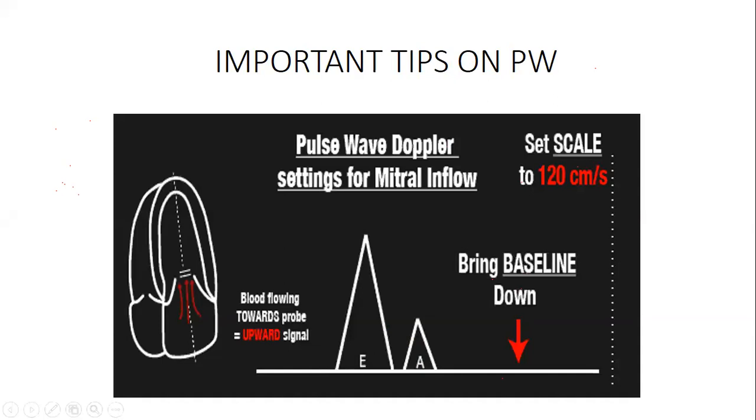The pulsed wave with the correct positioning towards the probe, upward signal, it's giving you that, and the A. The baseline, this is the baseline, okay? We'll explain it. Pulsed wave Doppler setting for mitral valve. We'll explain them very well. What is the key point on this one?